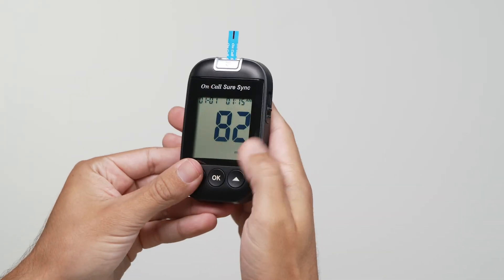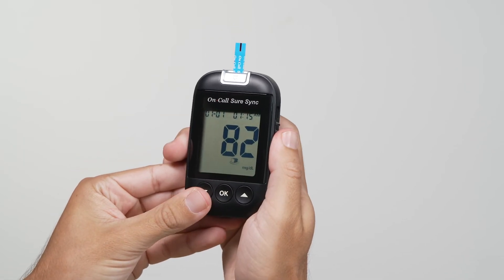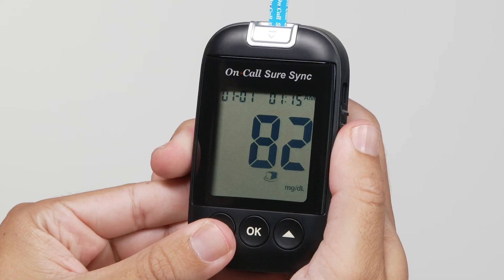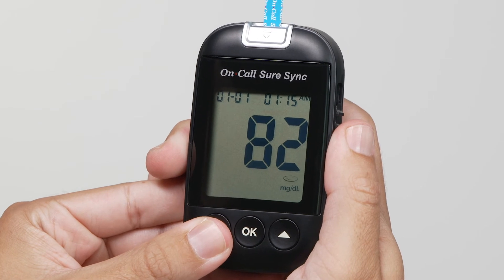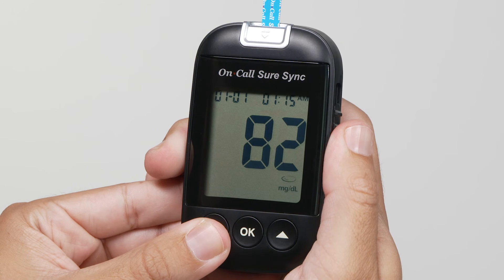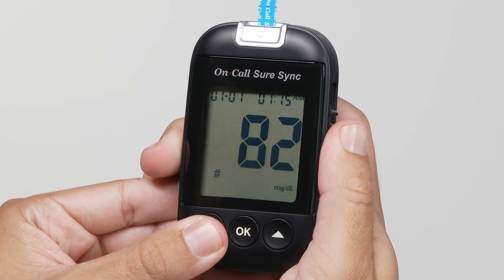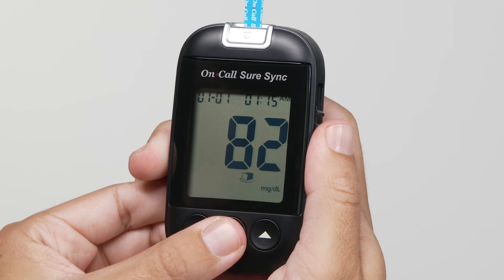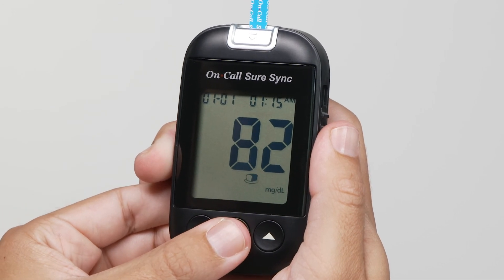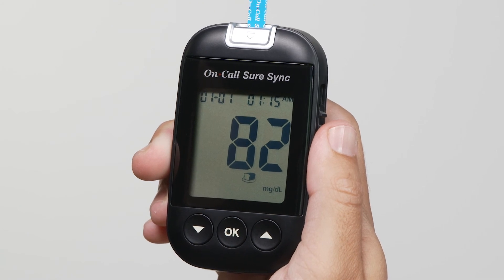Press the down and up buttons together to display the before meal marker symbol, indicating the result was taken before a meal. Press the down and up buttons again to display the after meal marker symbol, indicating the result was taken after a meal. After deciding the selection, press the OK button to confirm. The meter can accurately measure blood glucose concentrations between 0.6 to 33.3 millimoles per liter, or 10 to 600 milligrams per deciliter.